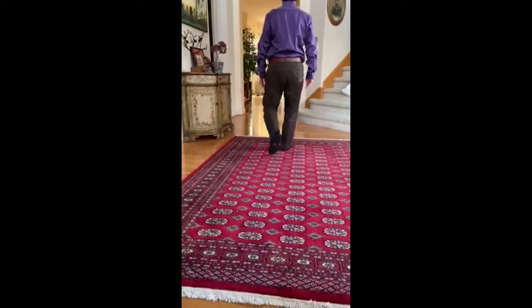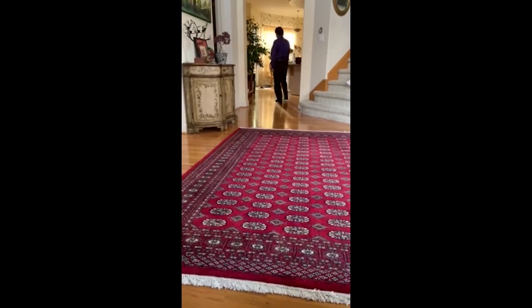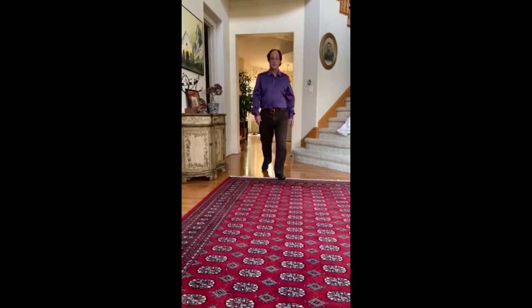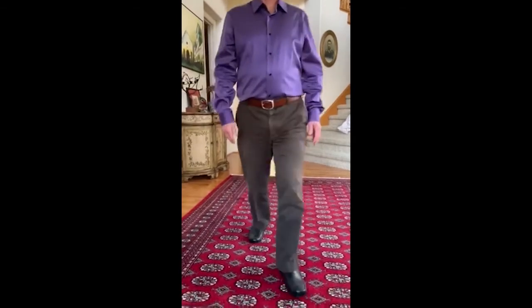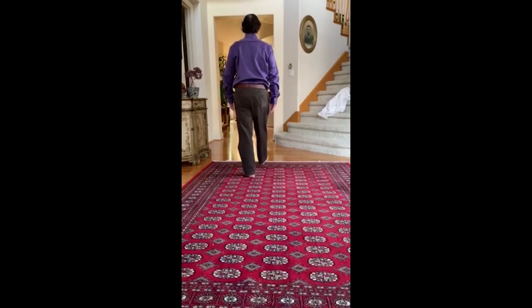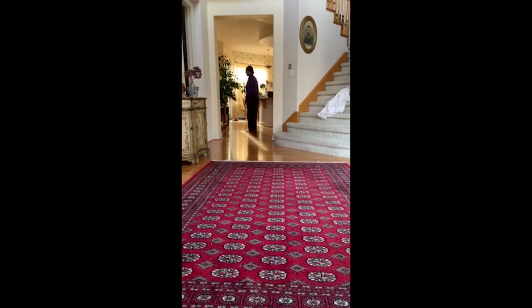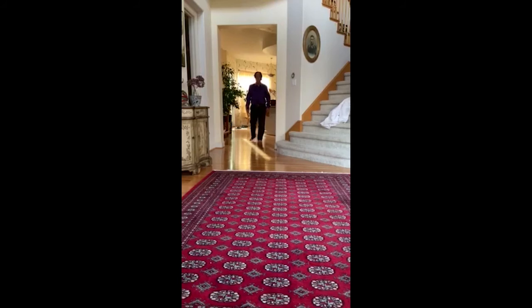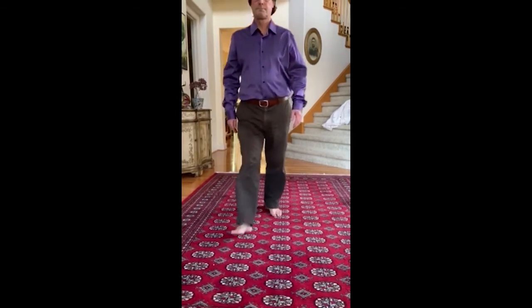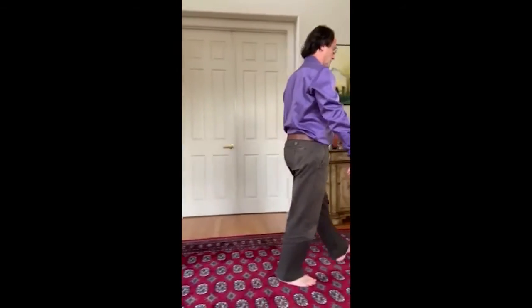We're walking forwards now. We are now walking forward towards the camera, as opposed to the other one walking backwards, because we needed to see forward and backwards with the shoes on. We are now filming backwards with the shoes off and barefoot. We are now walking forwards with the sideways view.